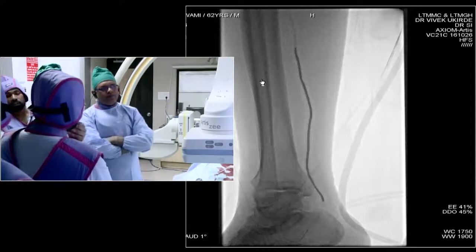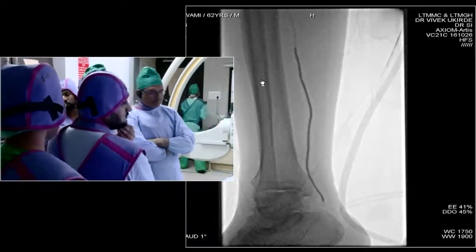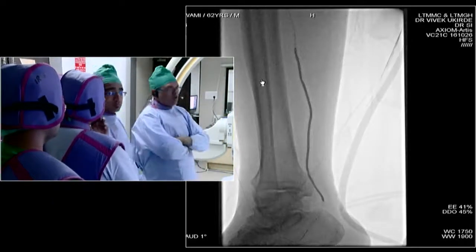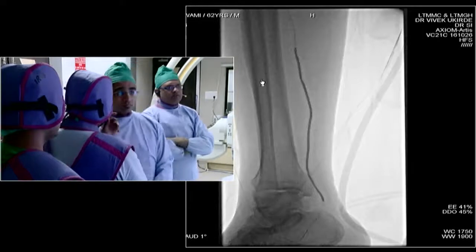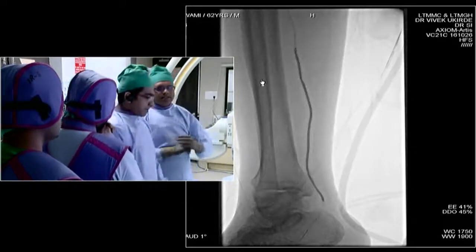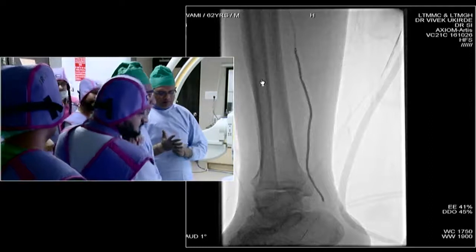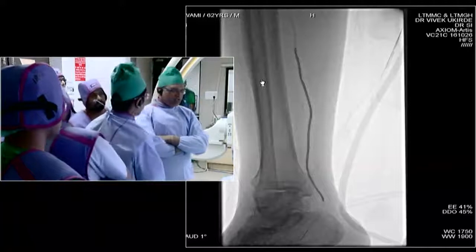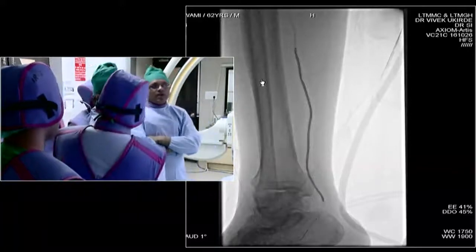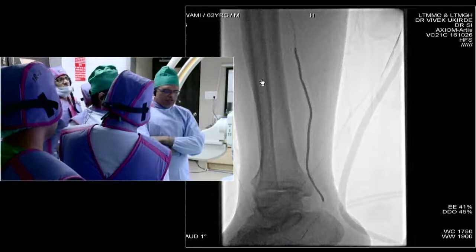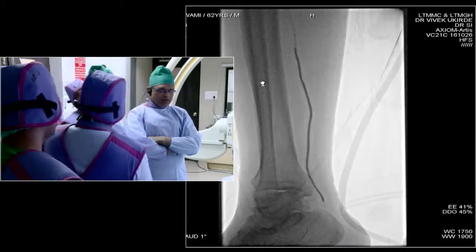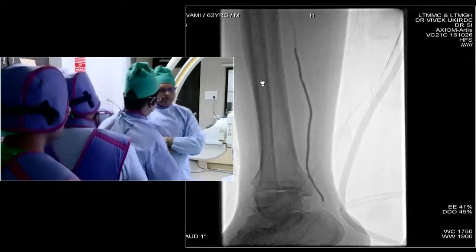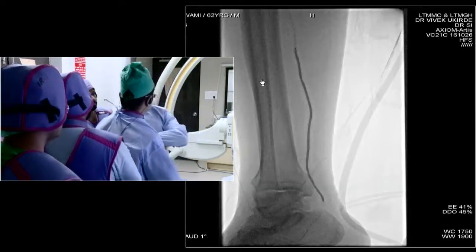How long do you normally keep the balloon inflated? About three minutes. Do you use drug-coated balloons in the tibials? Yes, we have used them, but in this case we are not planning to use one because we are planning to put a scaffold — which is sirolimus-coated — in the mid-calf region at the upper lesion.